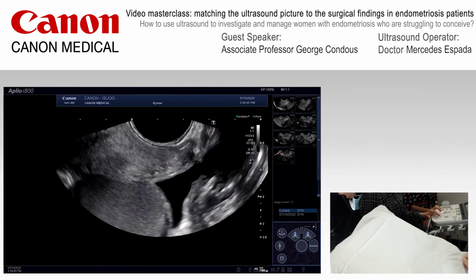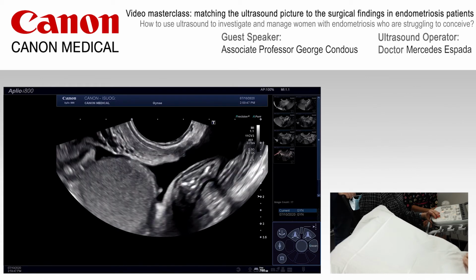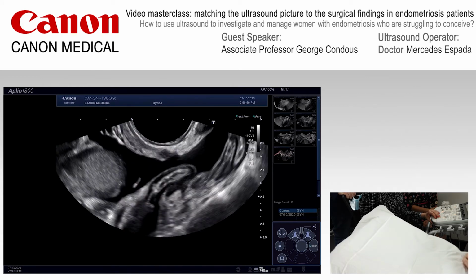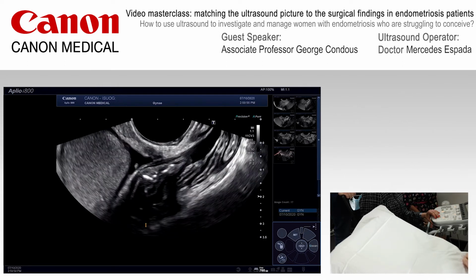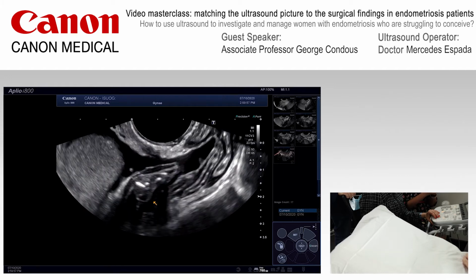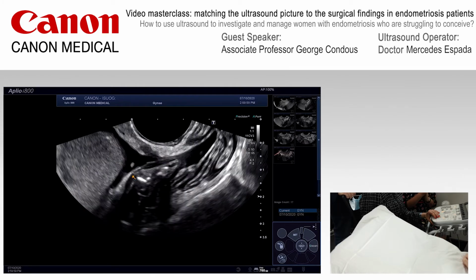And it's probably a little bit more, this is just re-highlighting the left uterosacral lesion just there. It's quite good also to use power or color Doppler, because sometimes you can get some vascularity as you sweep that probe, which is sitting now in the posterior vaginal fornix laterally towards the uterosacral ligament. Sometimes you can misclassify what appears to be a hypoechoic lesion with some blood vessel itself. So a nice trick when it comes to determining whether or not indeed this is a true left uterosacral ligament deep endometriotic nodule, which I think it is in this case.